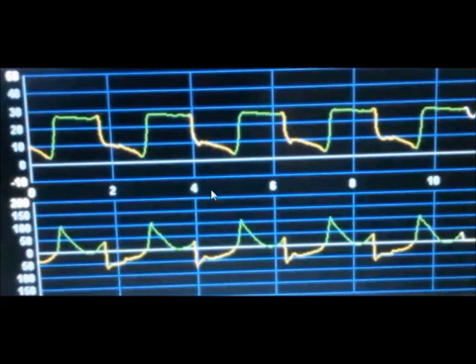And what's happening is this patient's in septic shock. They have metabolic acidosis and their inspiratory demand is very high. And what you're seeing here is this flow scooping. In pressure control ventilation, my flow should always decelerate towards a baseline. And as you notice, my flow is starting to decelerate. However, the patient's still sucking back and flow is rising again. So this is termed camelbacking. If you see this camelbacking, this is a flow asynchrony.